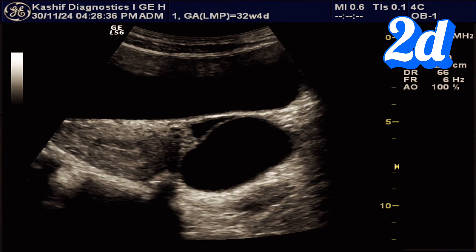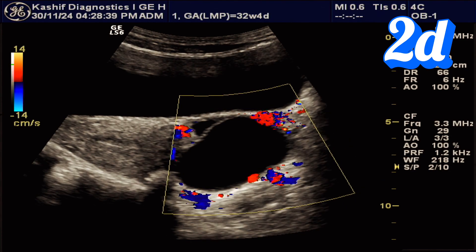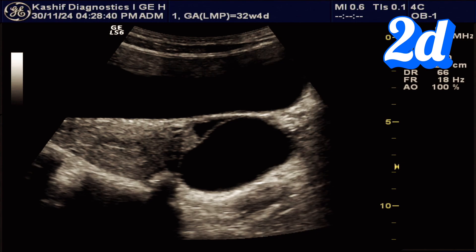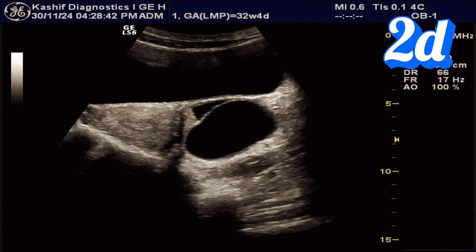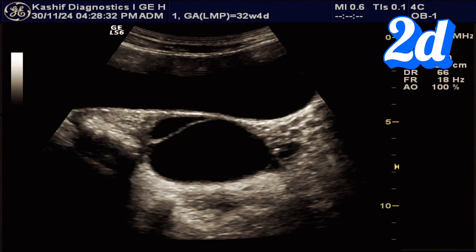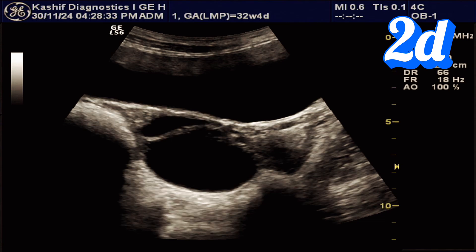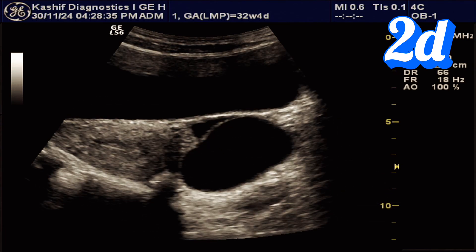There is no internal vascularity. The standard 2D ultrasound scan allows us to clearly visualize all the anterior, posterior, and lateral walls of the cyst.